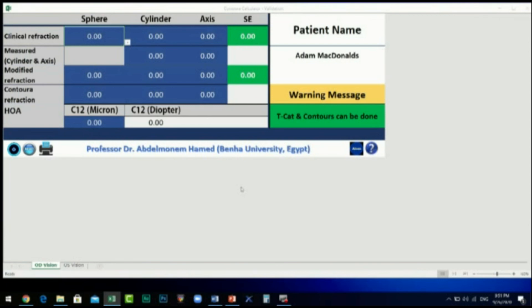Next is the Alcon icon — when clicked, it shows the Alcon protocol and the pre-calculation considerations. Lastly, the Query icon helps you understand what the other icons mean.